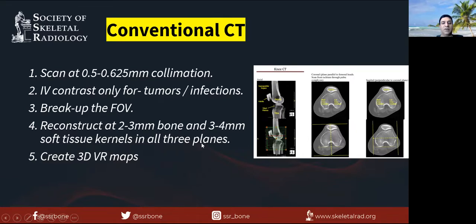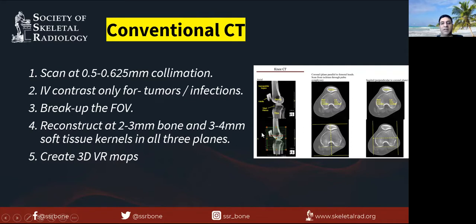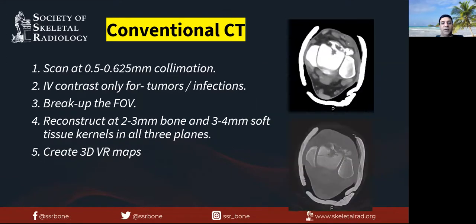These planes are oriented along the anatomy of the structures — not the body. For example, for the knees, it will be between medial and lateral epicondyle, versus for ankles, it's between medial and lateral malleoli. And finally, 3D volume rendered maps are also created.